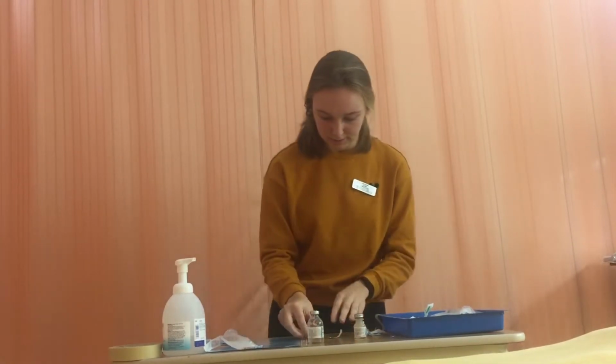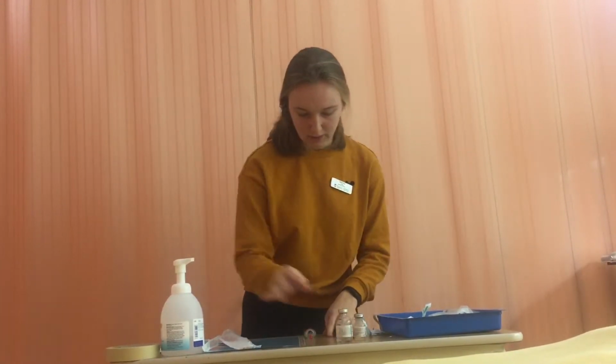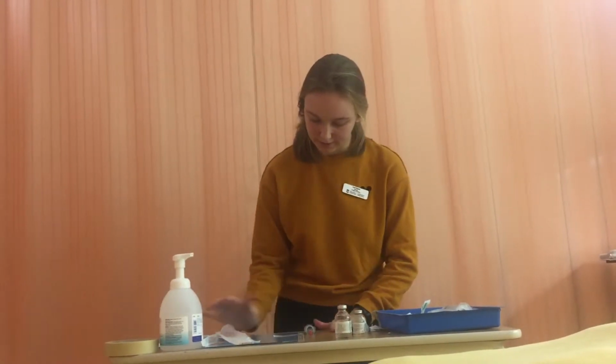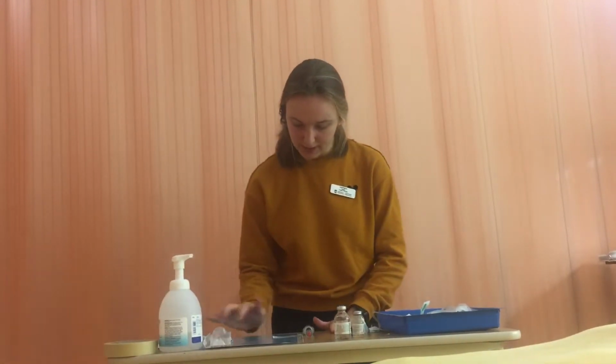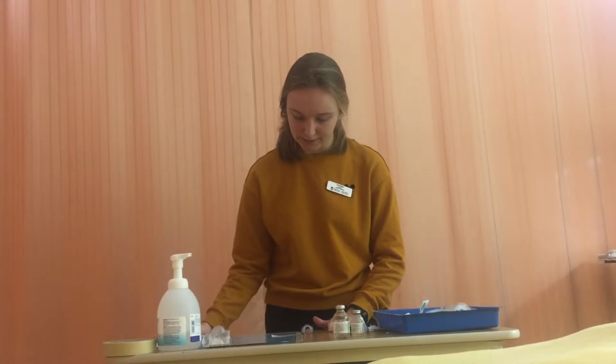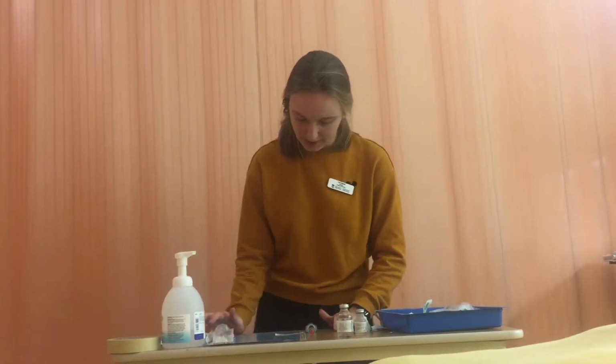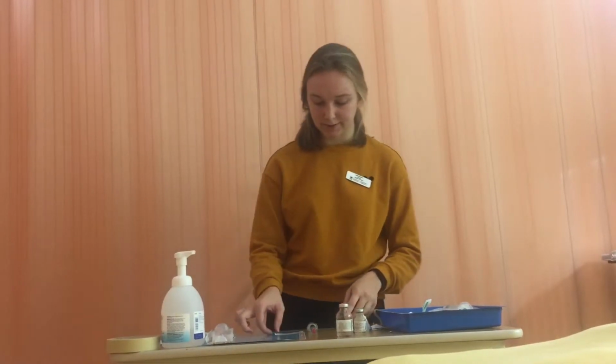And now I'm going to have my label here, which I already wrote up. The patient's name is Emma Wrightson. Penicillin G is the medication. The dose is 3 million units. The right volume is 6 milliliters, and we're going to be diluting it in 100 milliliters of normal saline.